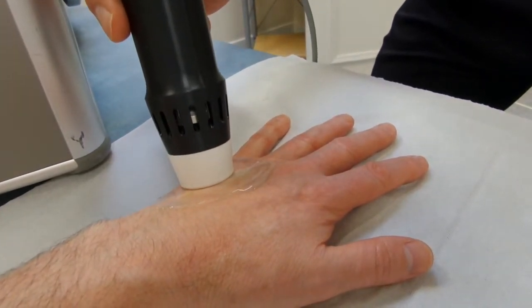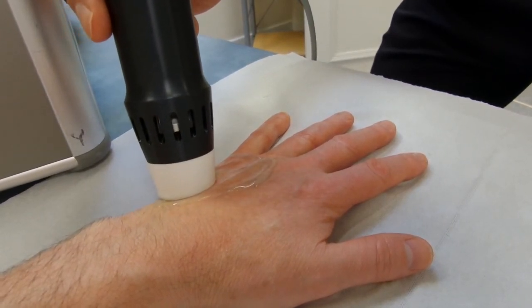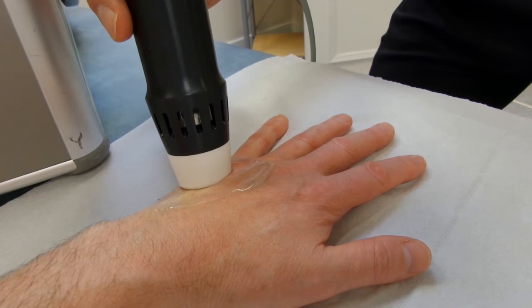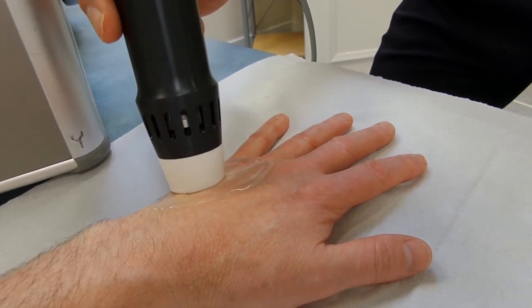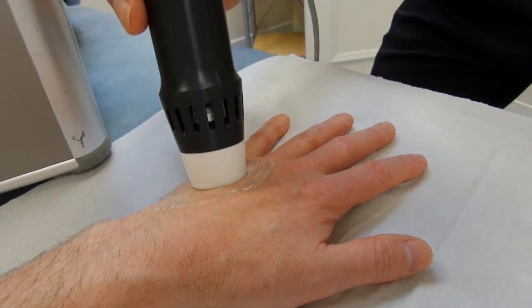You don't want to get too much redness and bruising if you can help it. See here we're just moving around still picking up gel and finding the resonant areas. Periodically just stopping on the resonant areas to concentrate for two to four hundred shocks there.